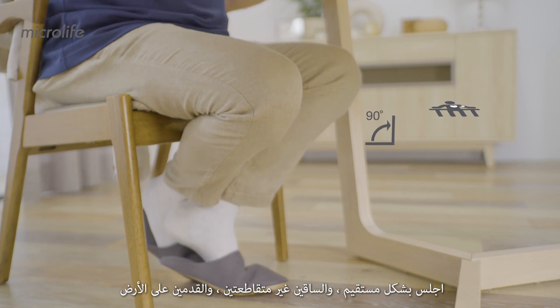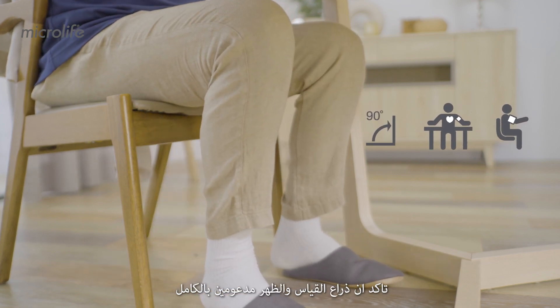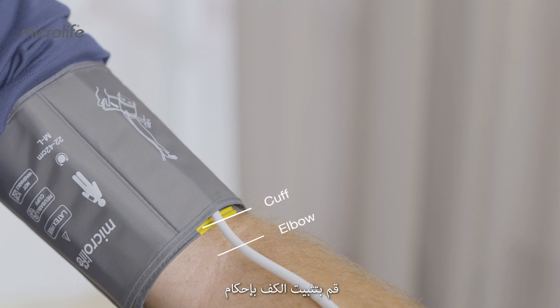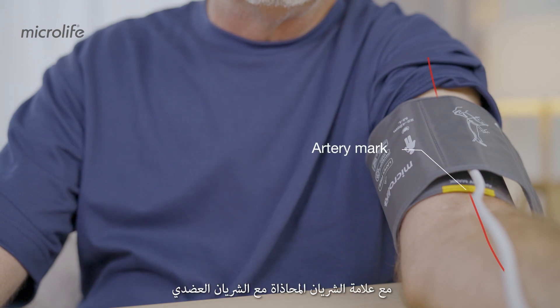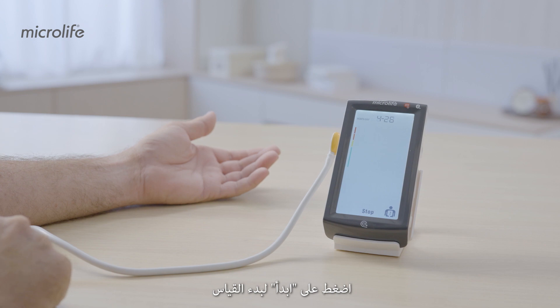Sit up straight, legs uncrossed, feet flat on the floor, with your measuring arm and back fully supported. Place the cuff above the elbow, then secure the cuff tightly. The cuff should be at heart level, with the artery mark aligned with the brachial artery. Press start to begin measuring.